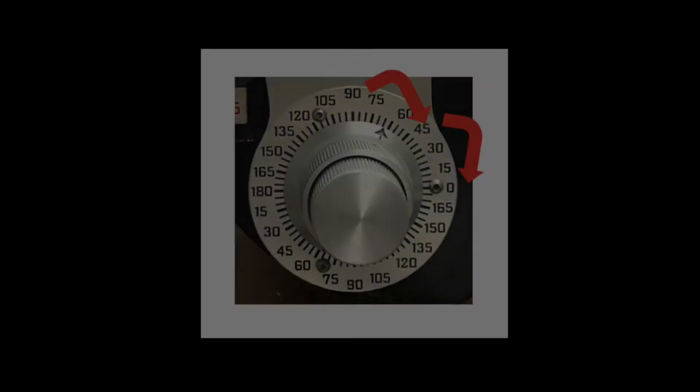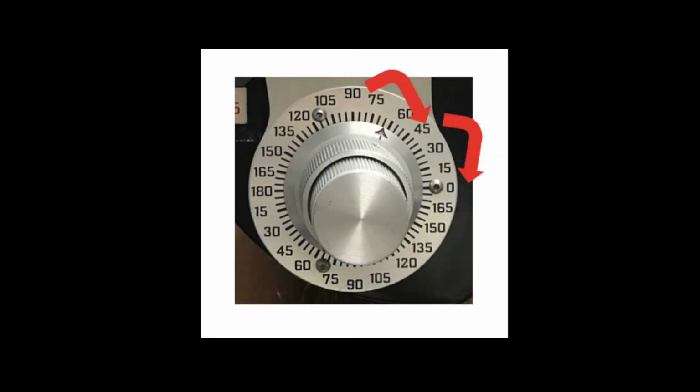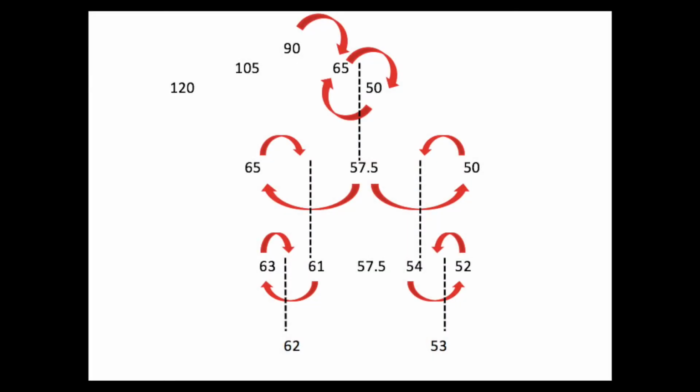After the patient decides, the axis wheel should be turned 15 degrees in that direction. Continue testing the patient and turning the axis wheel until their direction changes. At this point, the bracket lowers to 5-degree intervals, and the same process is followed until again the direction changes. Bracketing continues until the patient cannot tell a difference, ideally in a 1 to 2 degree range.